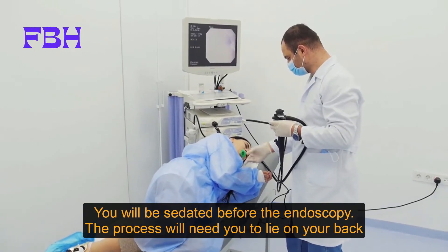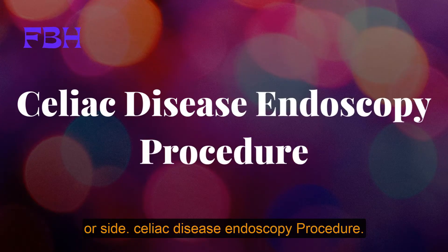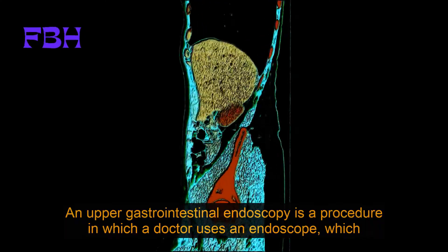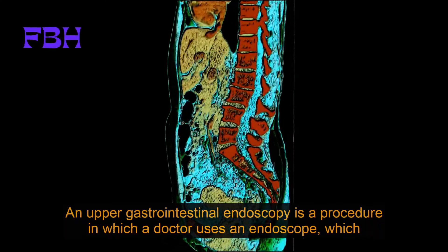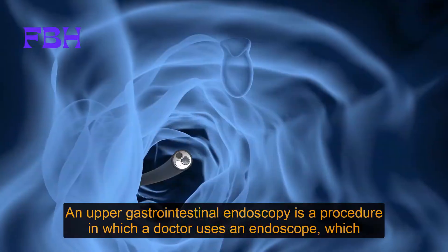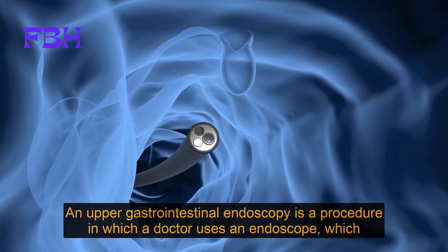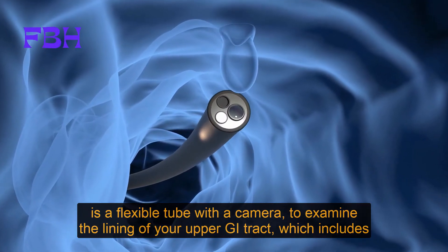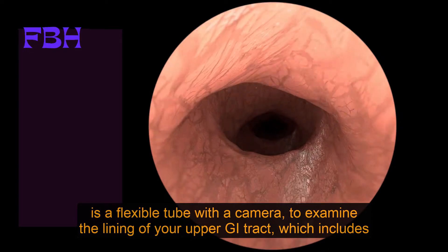The process will need you to lie on your back or side. Celiac disease endoscopy procedure: an upper gastrointestinal endoscopy is a procedure in which a doctor uses an endoscope, which is a flexible tube with a camera, to examine the lining of your upper GI tract, which includes the first section of your small intestine.